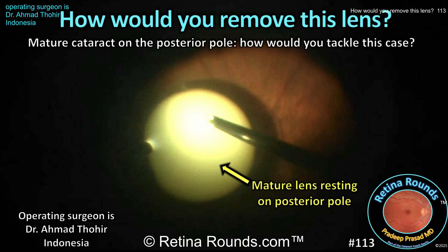Retina Rounds, episode number 113. How would you remove this lens? This patient has a mature lens that has dislocated to the posterior pole. Would you use the vitreous cutter? Or maybe you would levitate the lens up to the anterior chamber and remove it through a scleral tunnel? Perhaps your preference is to use a phacofragmentation probe. This case was shared with us by guest surgeon Dr. Ahmad Tohir from Indonesia. Let's see how Dr. Tohir removes this lens.